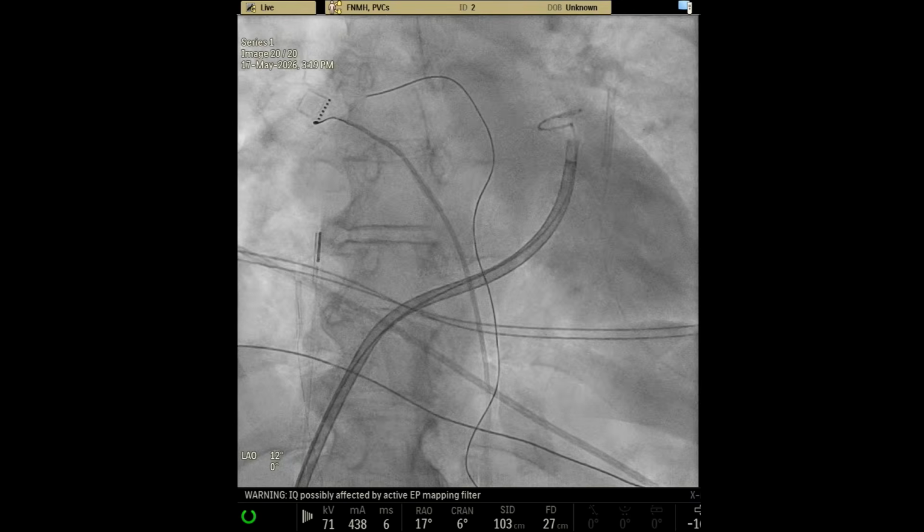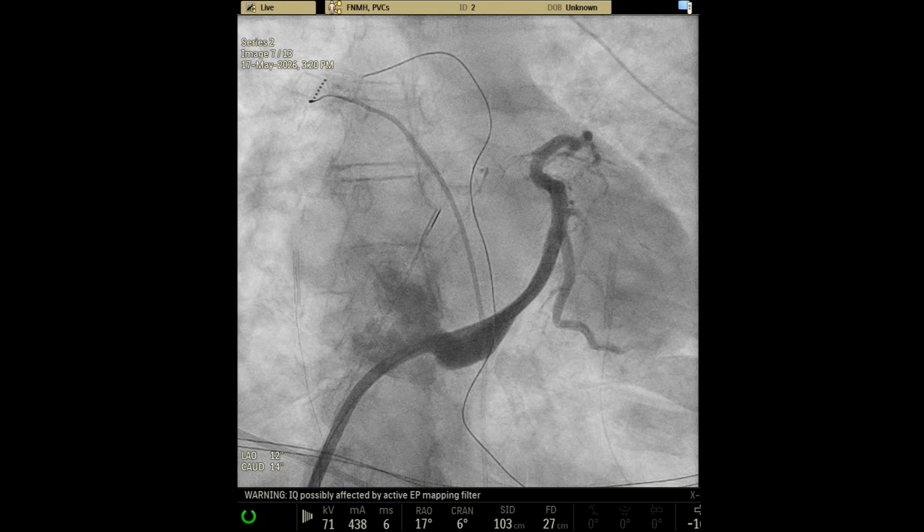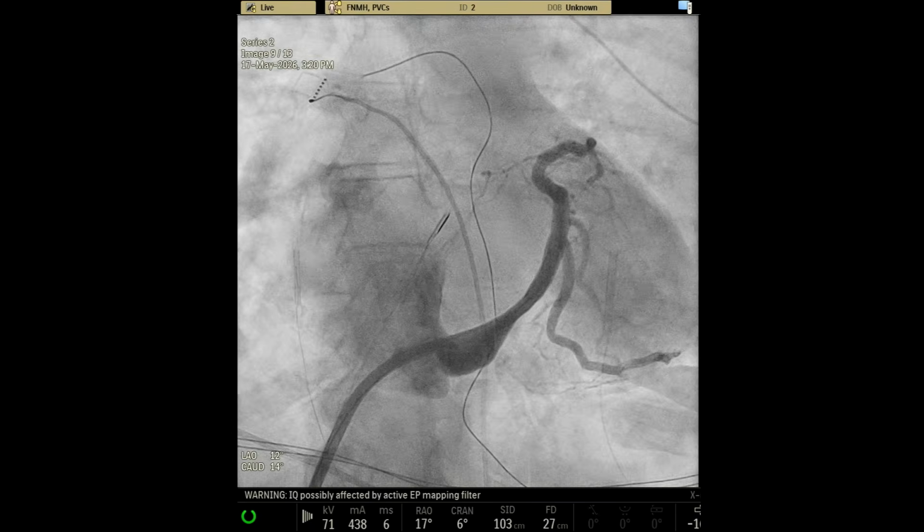This is the best support for an Agilis catheter to enter the venous circulation, and it doesn't have the risk of dissection that an ablation catheter would have, or a decapolar would have when you do this. So my favorite way, and what has proven in our workflow to be safe, is to put that guide wire all the way to the top, and then you follow the natural curvature of the coronary sinus. So you have to clock a little bit, next one, and then once you get to the great cardiac vein, now go back for a minute. Yeah, stop there.